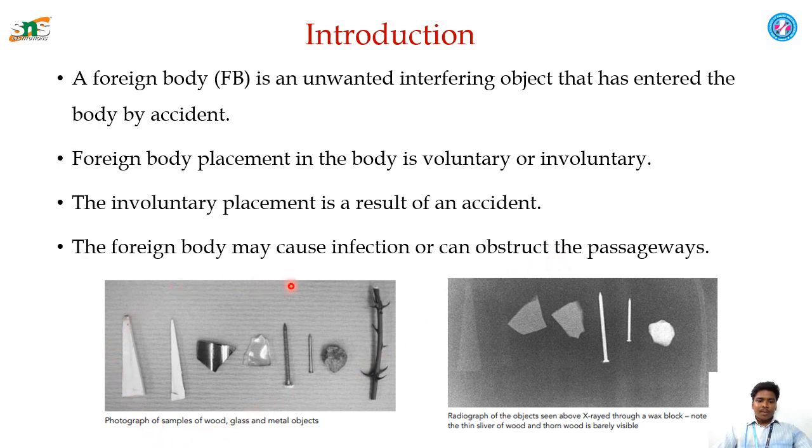Photograph of samples of wood, glass, and metal items, which are radiographic images of the objects. Based on the density of the object, the contrast of the image of an object varies.